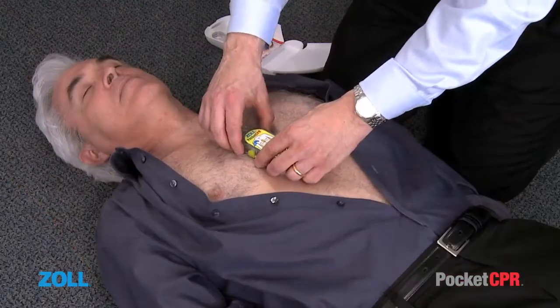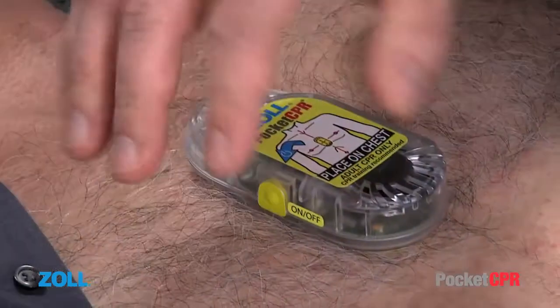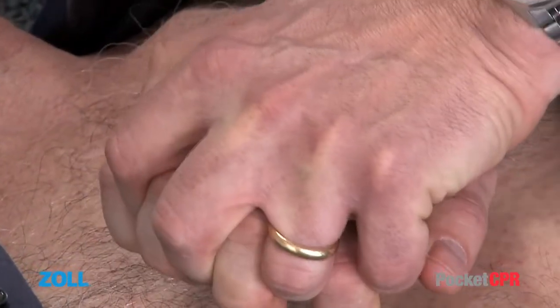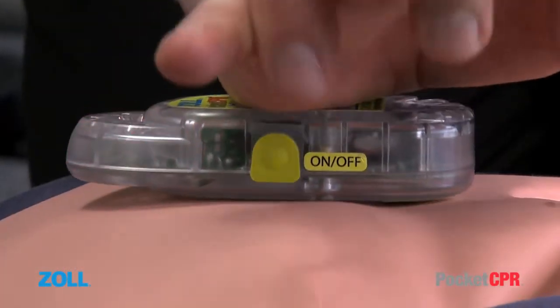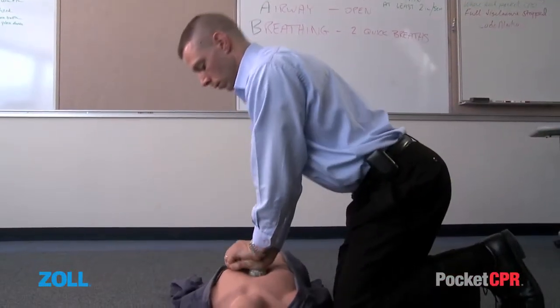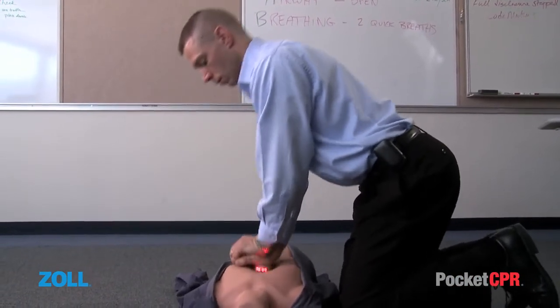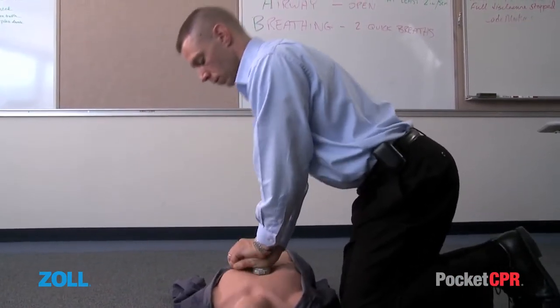Start CPR by putting the heel of one hand on the PocketCPR and the other hand on top, intertwining your fingers for maximum stability. Begin pushing straight down on the chest, keeping your elbows straight. The device will begin sounding a metronome tone 100 times per minute. Push once per beep. This will help you compress at the recommended rate of compressions.